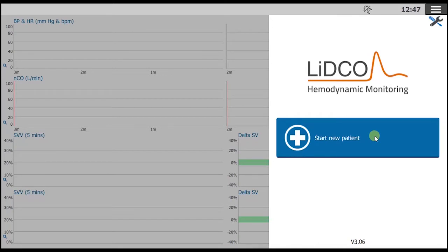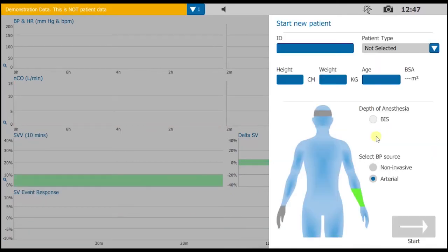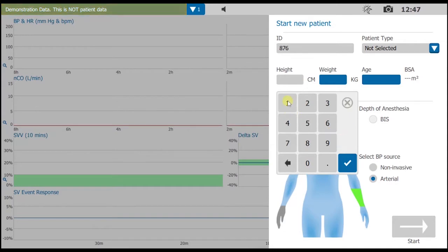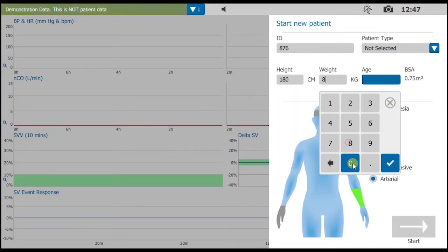Now touch anywhere inside the blue Start New Patient box to begin a new monitoring session. Enter the patient's details like this. Select ID and enter a patient identifier, then height, weight, and age.